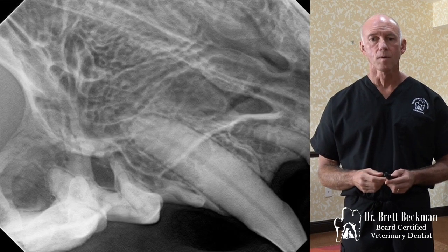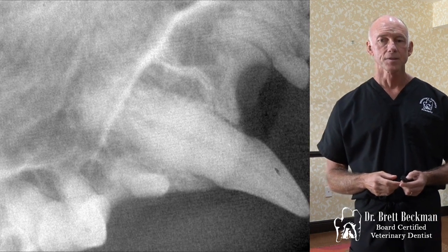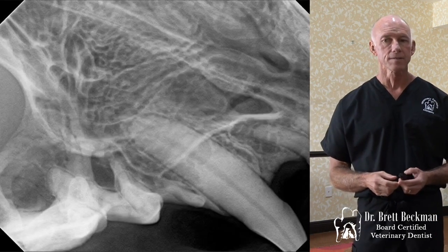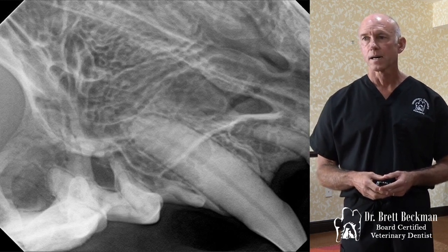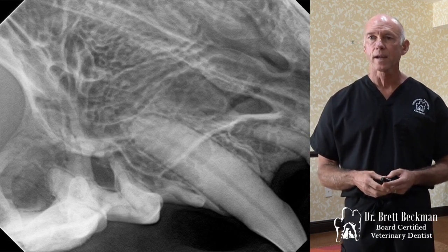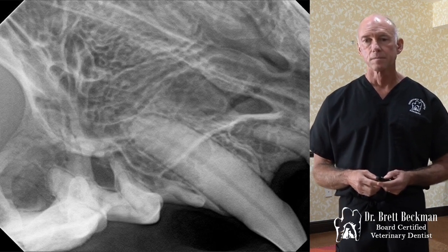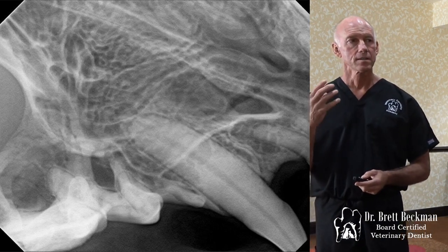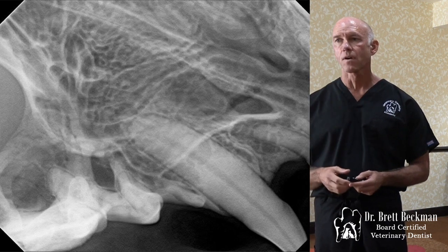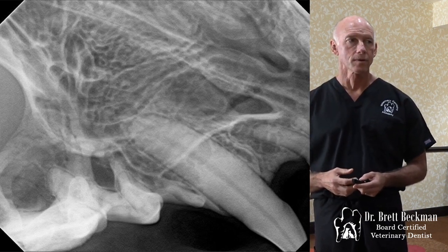So there's normal. So you've got that where you've got the ghosting. There's no real discernible tooth structure, and then you've got that where you've got very easily visible tooth structure all the way up, periodontal ligament space, nice and discernible. So that's a normal for contrast. And that lucency, that's just the air in the skull, nasal cavity superimposed over the image. That's normal.